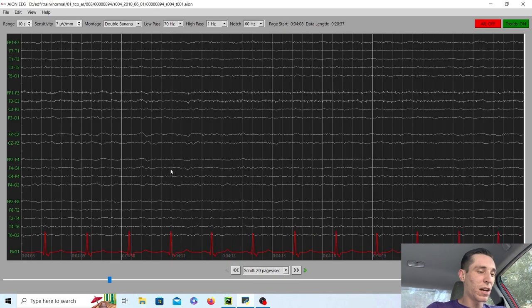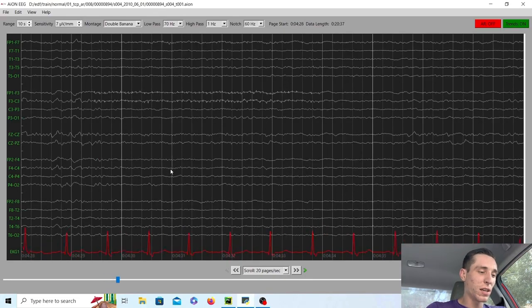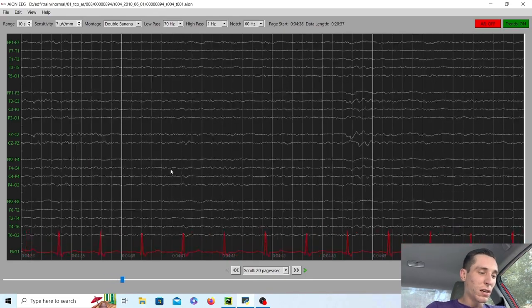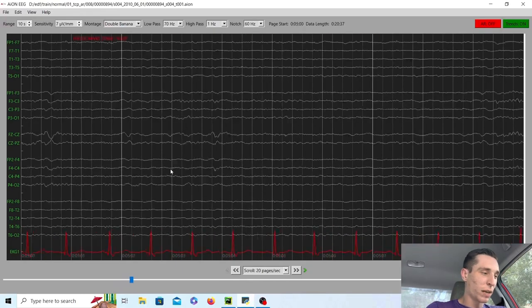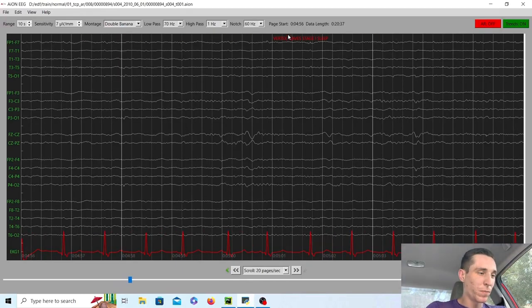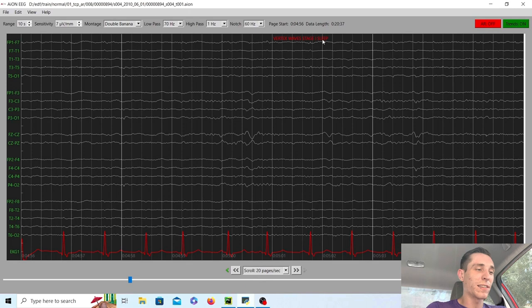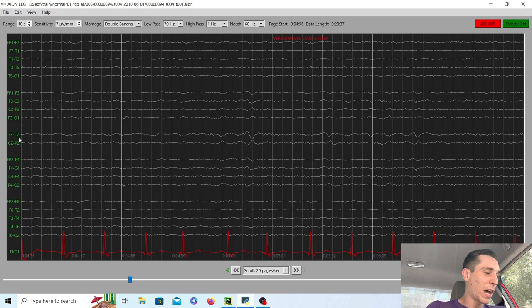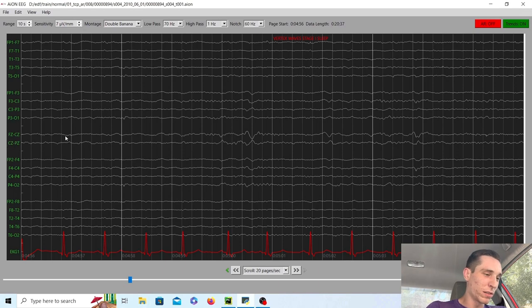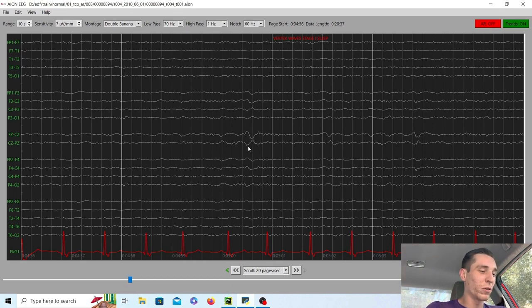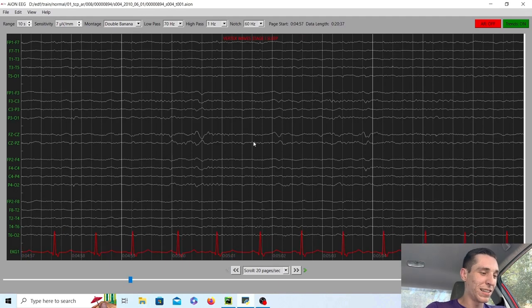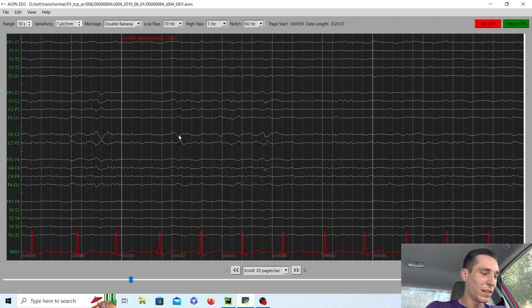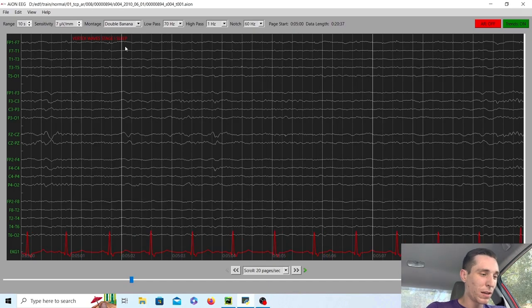And now we will start to see some vertex waves right here. So vertex waves are a sign of stage one sleep. They are a normal thing and they're going to happen in the CZ area. What does it look like? It essentially looks like at CZ, they're going to be kissing the waves. It's going to be a little sharp wave and they're going to be kissing at CZ right there. Little vertex waves. And that's a sign of stage one sleep.